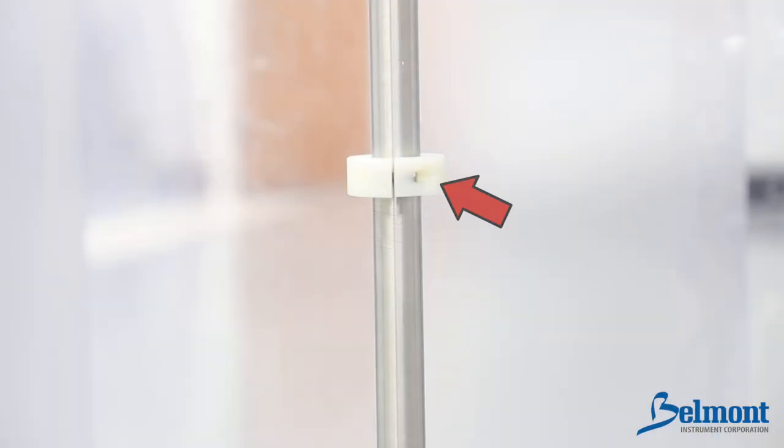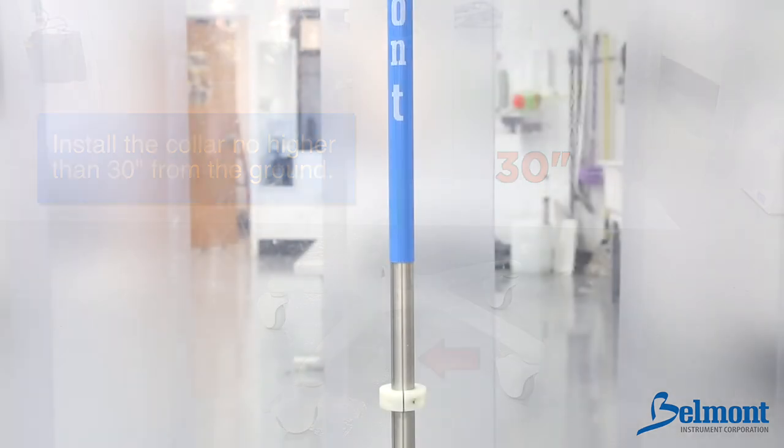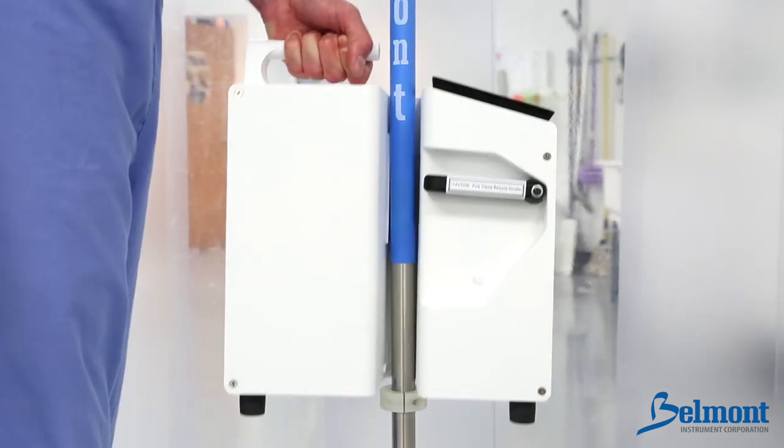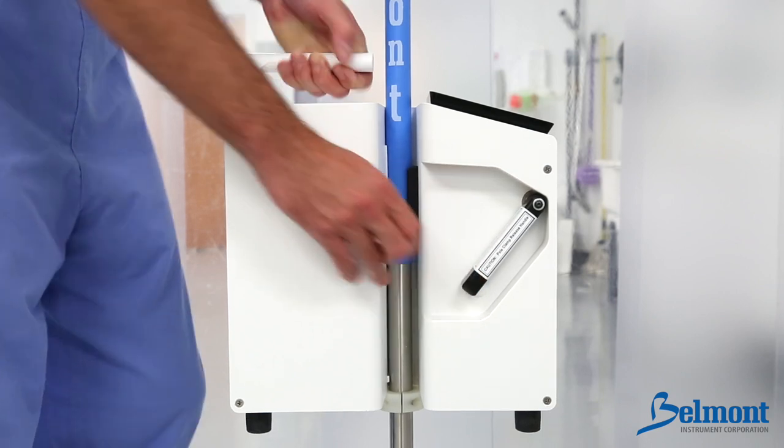First, install the collar on the IV pole just beneath the system, no higher than 30 inches from the base of the IV pole. Mount the system above the collar by pushing down on the pole release handle. Check that the system is secure before proceeding.